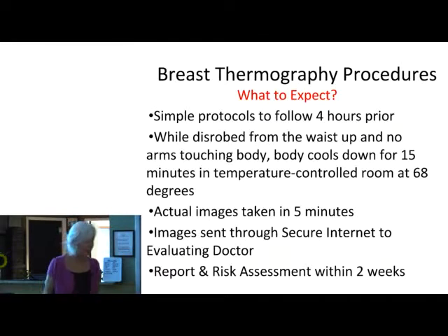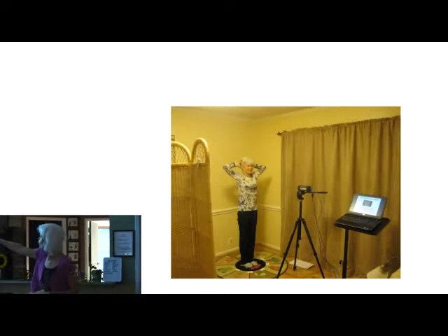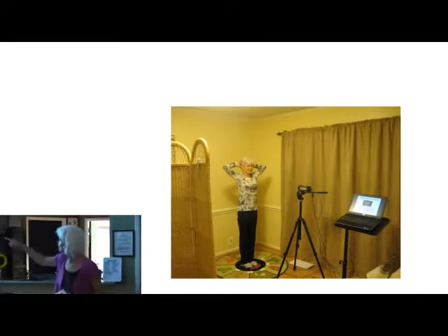And once the 15 minutes has passed, I put you on my, why don't you do the next slide. That's my positioning rug, my little foot rug, that positions you for all the images I will be taking of you. So this is my thermography room, that's my camera and laptop. The laptop takes the images. And you do have to put your hands behind your head. And of course, I could not really show you exactly how it is because I couldn't disrobe for this, but you'll have your top off during that time.